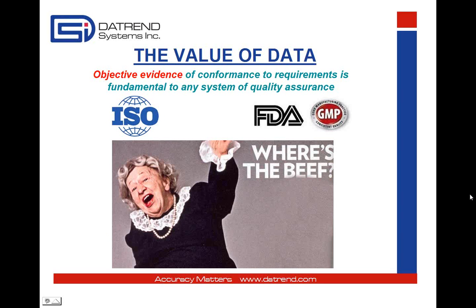The value of saving records of inspection and test data is controversial. Some hospitals follow the practice of exception-based reporting. This is where all the observations seen during a PM are reduced to one or two summarizing codes, and the detailed PM results are discarded. It's a way of coping with limitations of some systems where the service history has to be input manually from paper records.